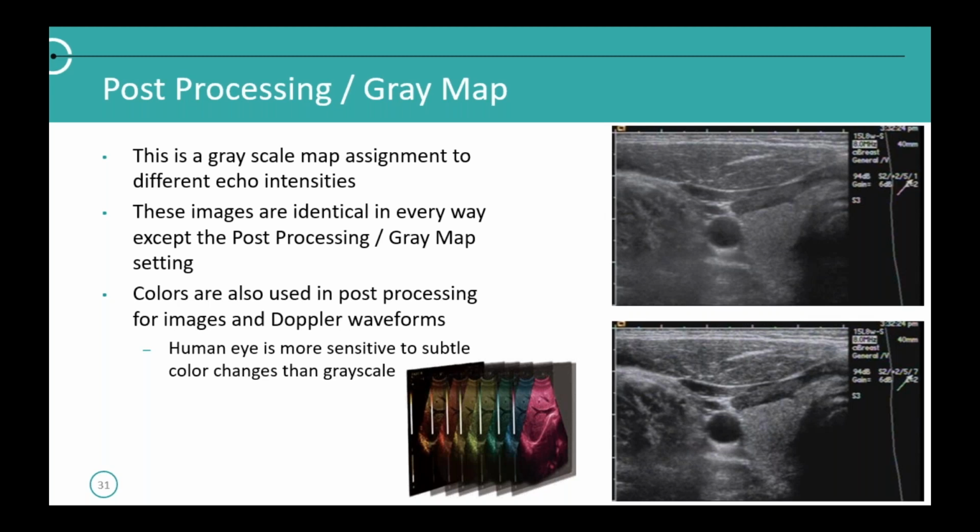And there's another thing that sonographers might do. They might add a color overlay on top of an image, just because in some conditions it's easier to see structures with some color versus black and white. So they make yellow masks and blue masks and magenta, whatever your favorite sonographer likes to use. Sometimes that helps them see the structures a little differently than just black and white.